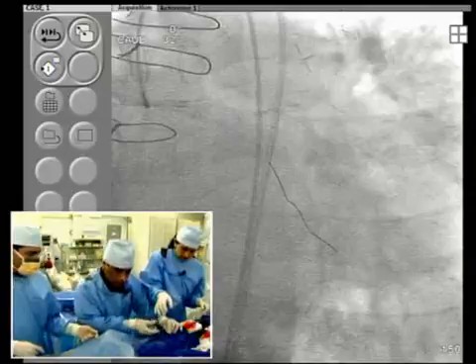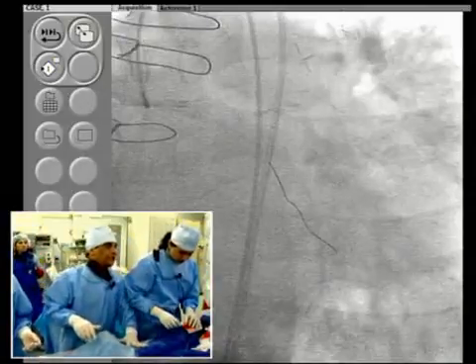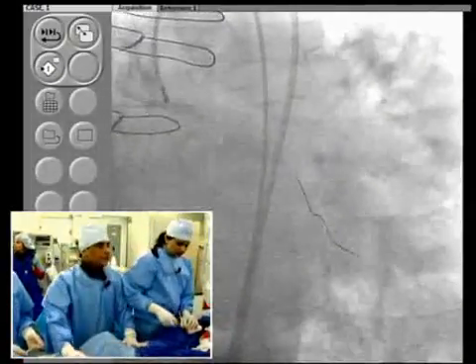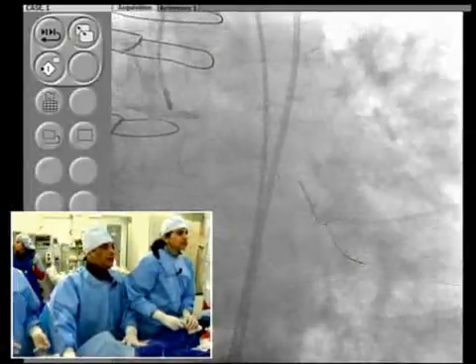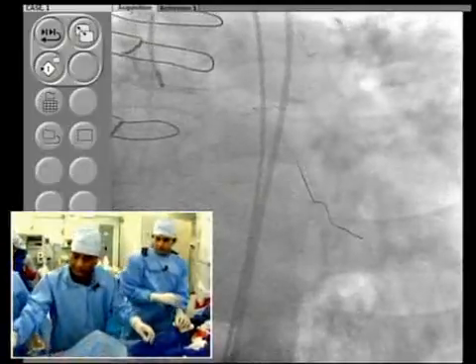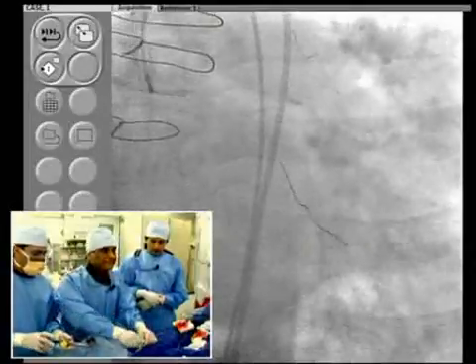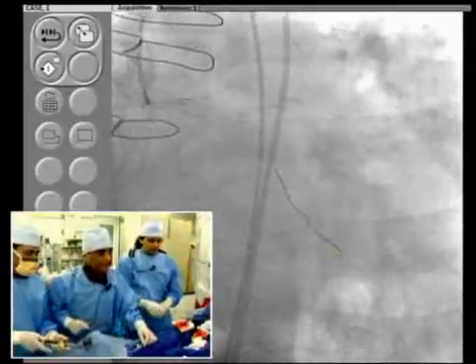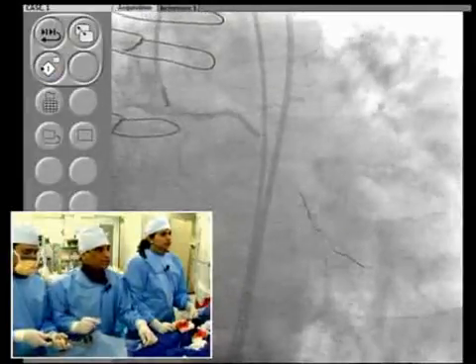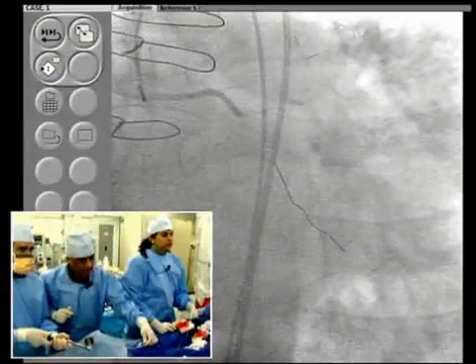So what we will do in this particular case, clearly we will not have a chance for the rotational atherectomy of the LIMA distal LAD. We will make it on June 17th, which is the Thursday for our live symposium, and at that time we'll try both. Open this, give it a second try for this total occlusion of the OM, and do the LAD rotational atherectomy via LIMA.